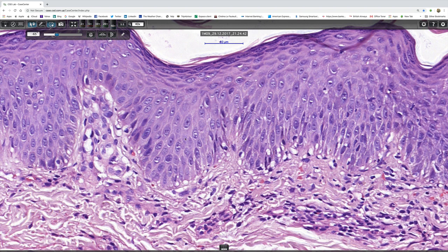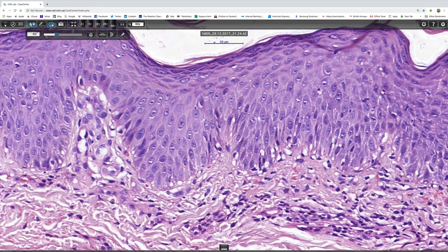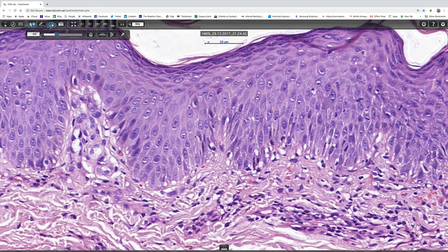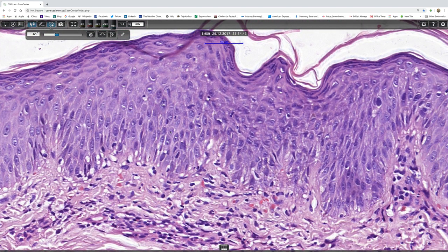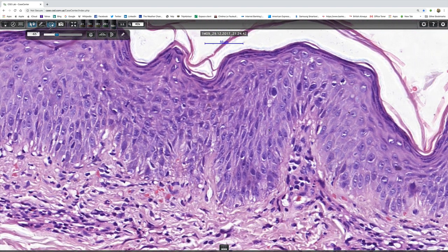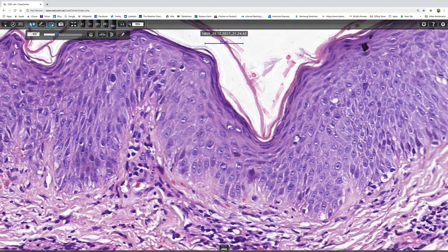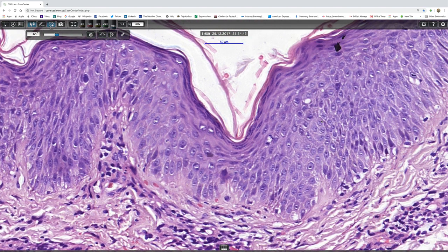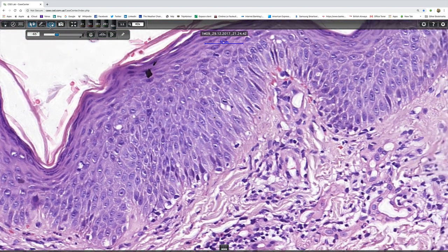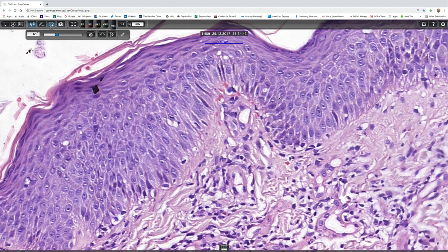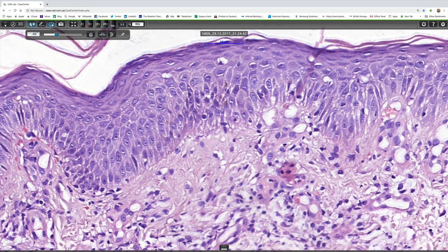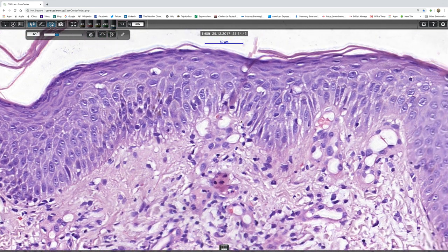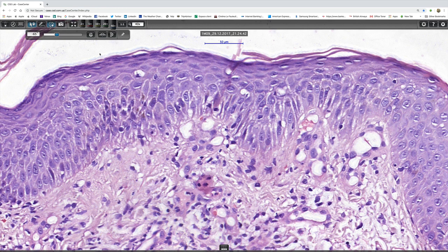And that's the very first sign that you see in psoriasis. If there was nothing else, that on its own in the right context would be sufficient. There you get it there. There's even a little bit of red cell extravasation there. And there again, we've got these vessels dilated. And there's a papillary dermis there and there with more dilatation of these loops.